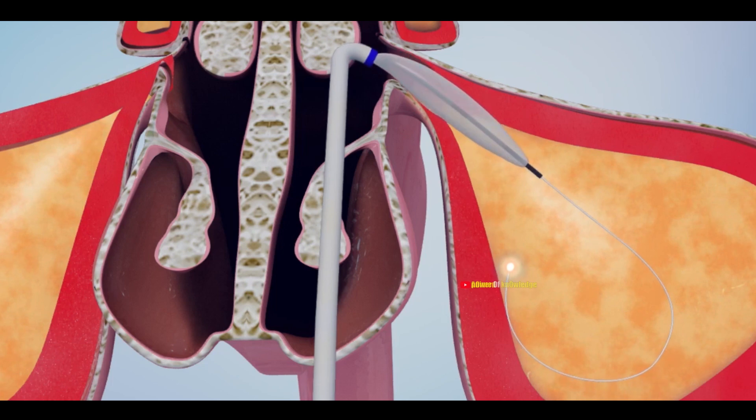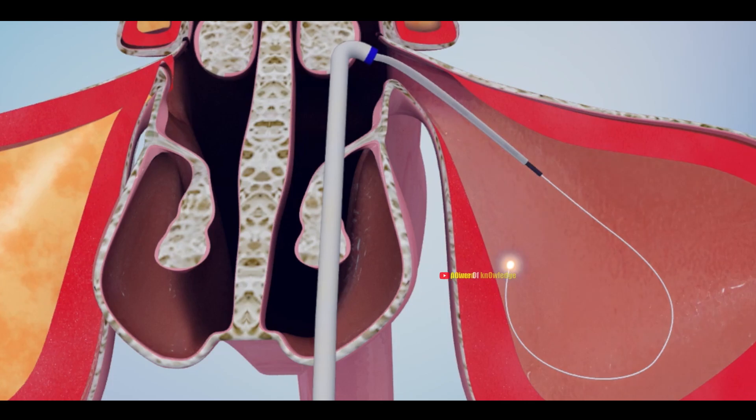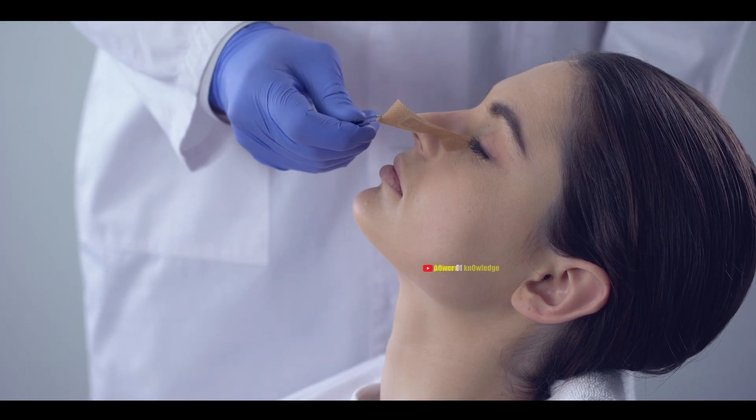After inflation, the balloon is deflated and removed, allowing trapped mucus to drain. This procedure is safe and useful, and you can go back home on the same day.